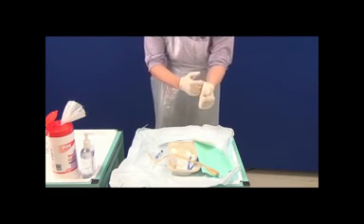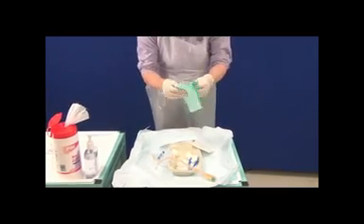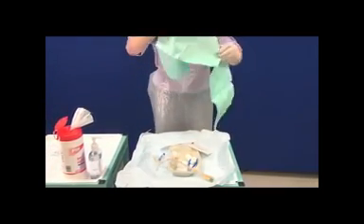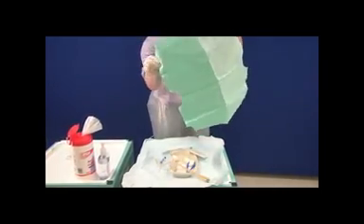Now you've got your sterile gloves on, do not touch anything that isn't sterile. Take your drape and ideally ask your assistant or the patient to uncover themselves at this point, if not previously done, and place it over your patient, as seen here, whether male or female.